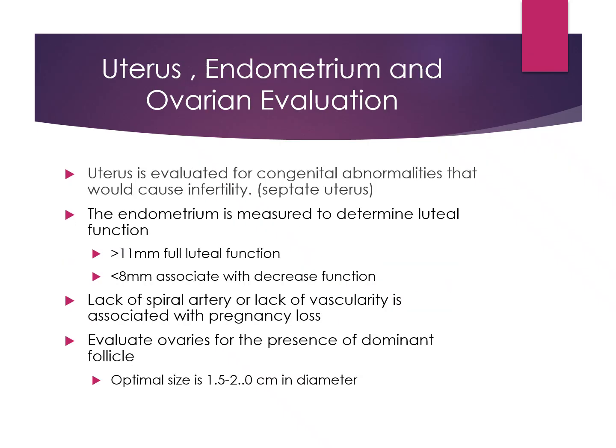So we know how to treat infertility, but we have to do a pre-evaluation before we can decide which fertility treatment is going to best suit our patient. And this is where infertility clinics rely on ultrasound techs to be able to evaluate the uterus, the ovaries, and the endometrium. So infertility is defined as an inability to get pregnant after trying for 1 year.